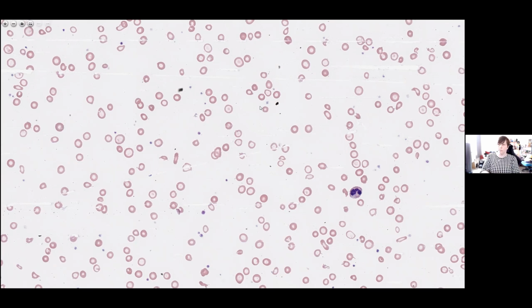Excellent. So I think most people, rightfully so, in a woman of this age have explained the iron deficiency by menorrhagia, or heavy vaginal blood loss, menstrual blood loss. And we've got some other comments here in terms of acute blood loss. Do we tend to see this kind of picture in acute blood loss due to trauma or any other cause?